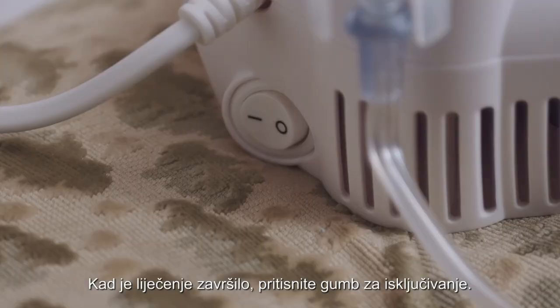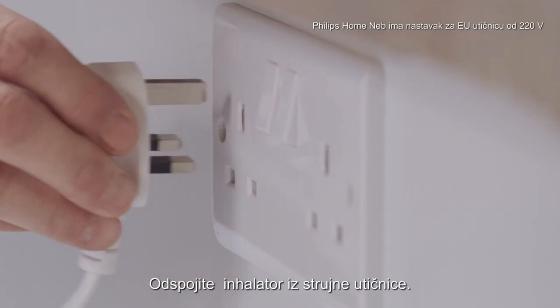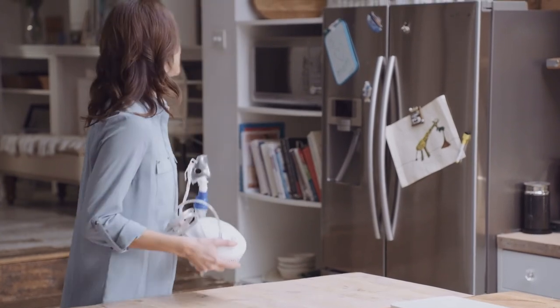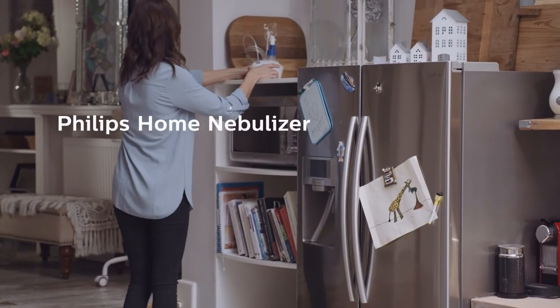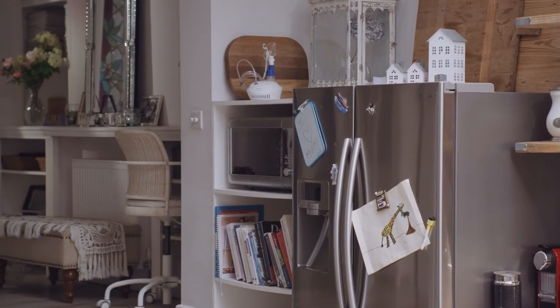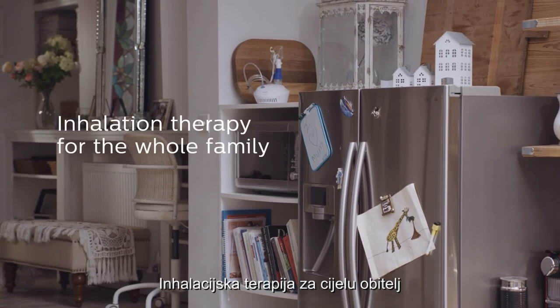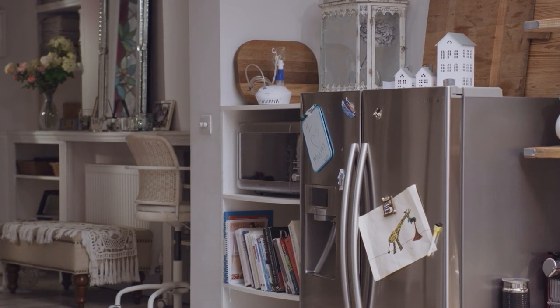When the treatment is complete, turn the power switch off and unplug the device from the electrical outlet.